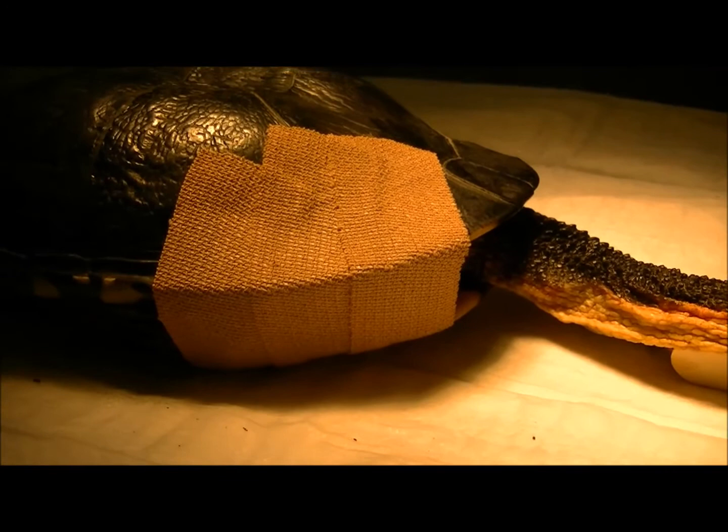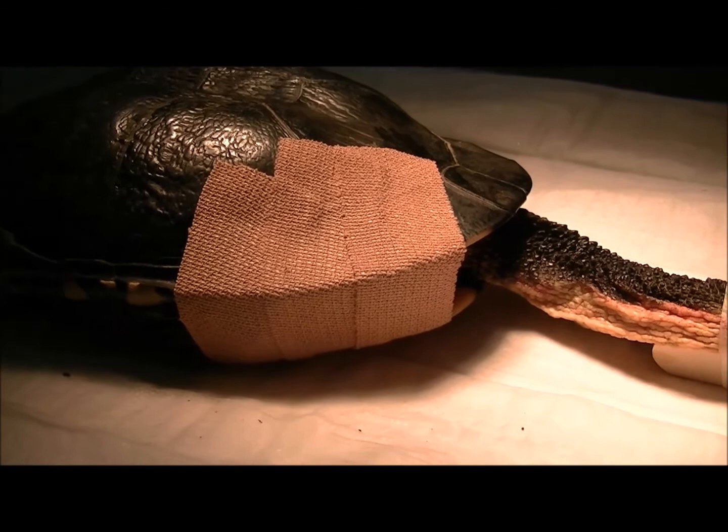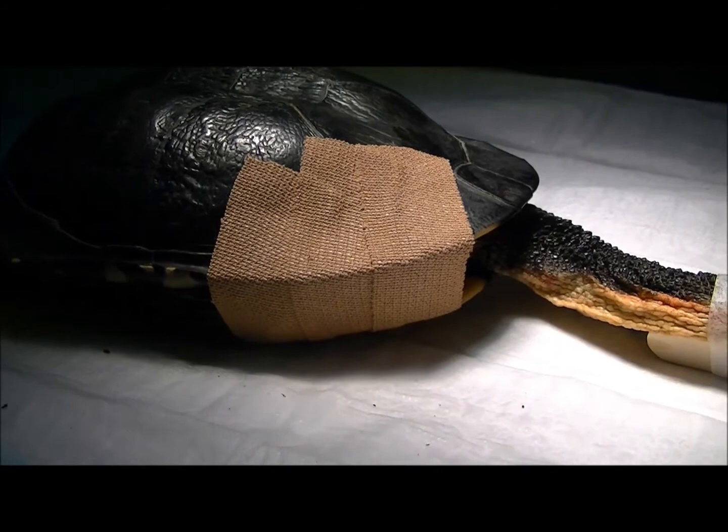We'll leave that bandage on for about six weeks. This Elastoplast product will stay on for a little while in the water. My aim is to get her back into the water pretty quickly — not for a couple of days initially, and then we'll put her in for half an hour to an hour a day in nice clean water until those stitches and the skin are a bit more sealed. The Elastoplast may lift off at that point, but it's cheap and easy to put a new one back on if need be. Hopefully in about eight weeks time we'll have this turtle back out into the world.